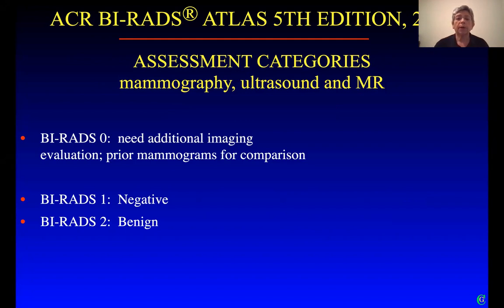Most of what I'm going to talk about this evening deals with the concept of the probably benign lesion as it applies to mammography. I'll say a few words at the very end with respect to ultrasound findings. I will not be talking about probably benign lesions in MR at all.